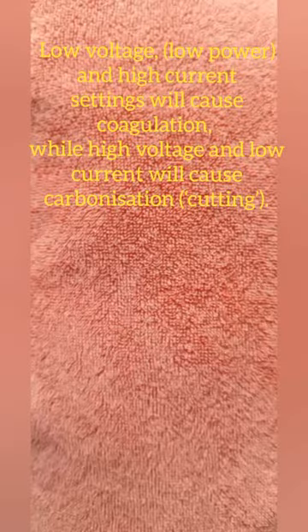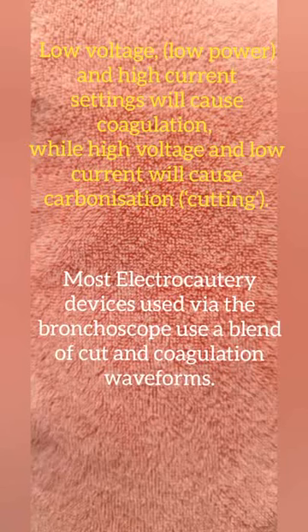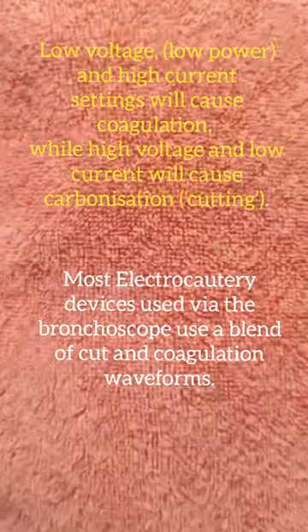Also, I said that low voltage and high current settings will cause coagulation, while high voltage and low current will cause carbonization or cutting. A mix between the two effects is called blend effect or blend mode, and most electrocautery devices used via the bronchoscope use a blend mode of cut and coagulation.